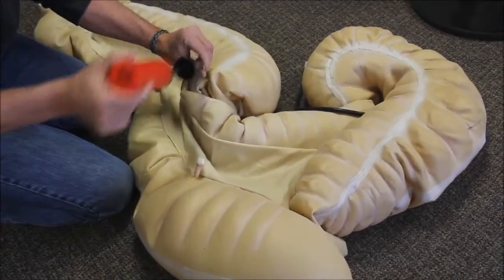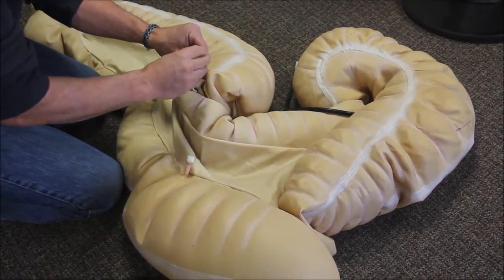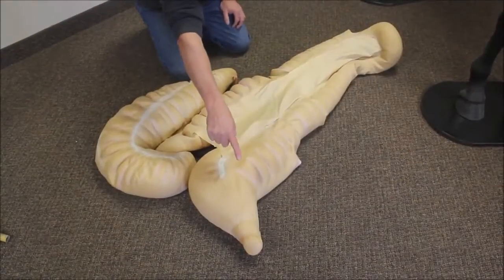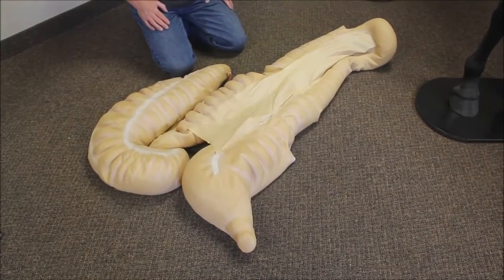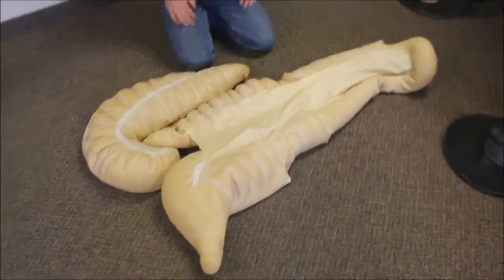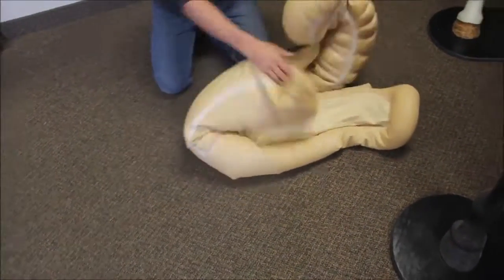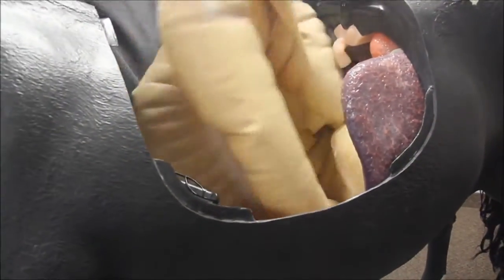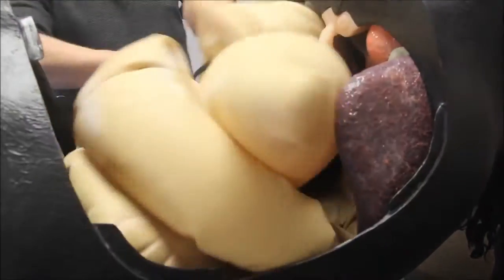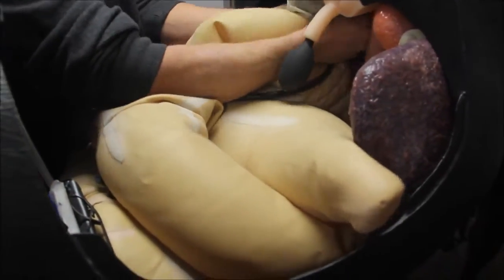The equine GI tract is an inflatable latex unit. Care must be taken not to over-inflate any of the five compartments. The transverse colon connects here, this is the cecum, and here is the pelvic flexure. To install it, fold the unit as shown and place it into the horse. The black tube connects to a D-ring located in the dorsal wall within the horse.